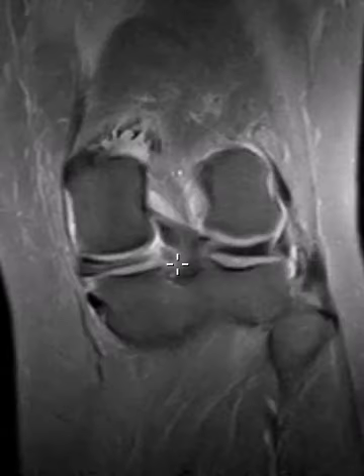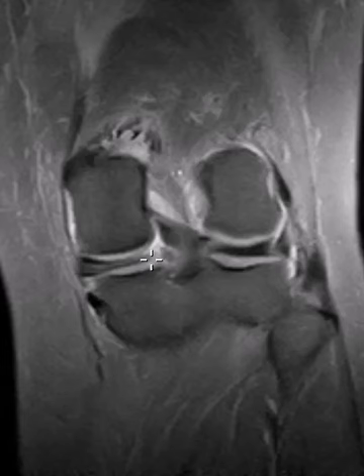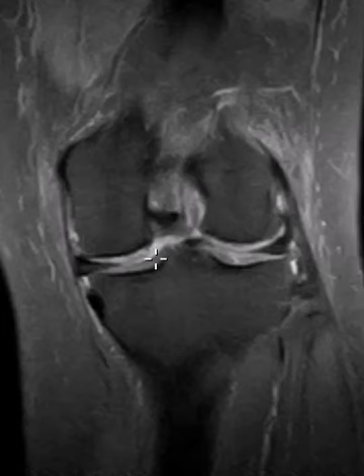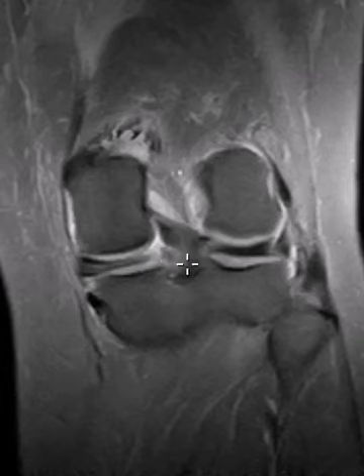You can see that all the time. Sometimes it's right at the root itself, right where it attaches to the bone, and it's less obvious. Sometimes it's here at the junction between the root and posterior horn, and you can see it much better. Sometimes there are other places, but this is one of the more common places. Thank you very much and hope you have a great day.